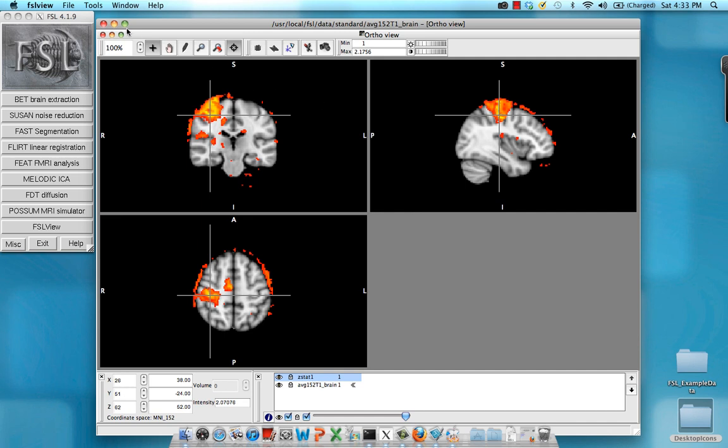So really, that's all there is to carrying out a very simple group level analysis. If you had more runs, obviously you would run the same analysis we did for each individual run for each of those runs. And then when you're finished with all your runs, collapse across them and run a group level analysis.